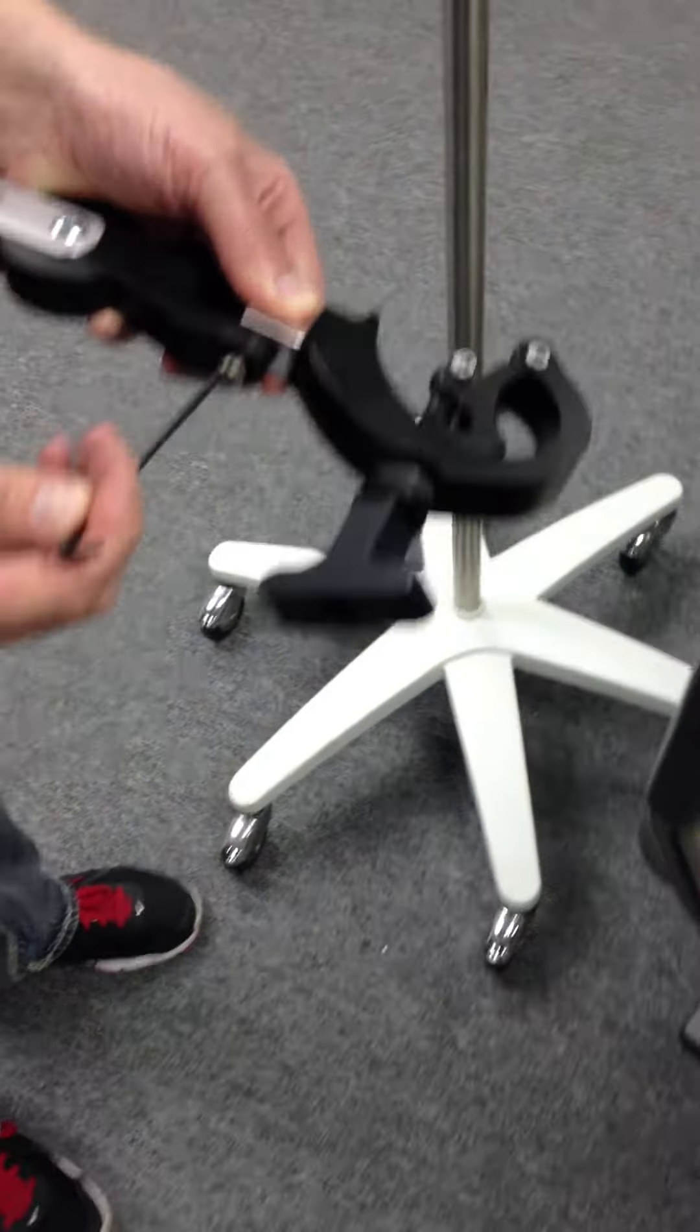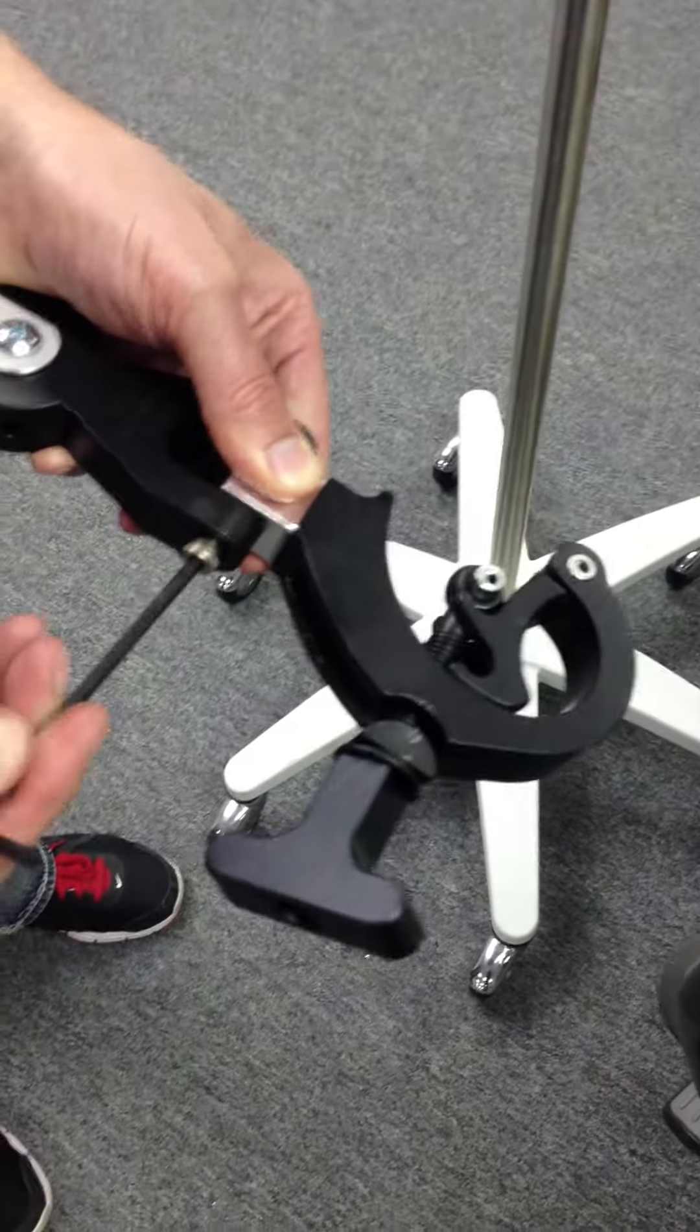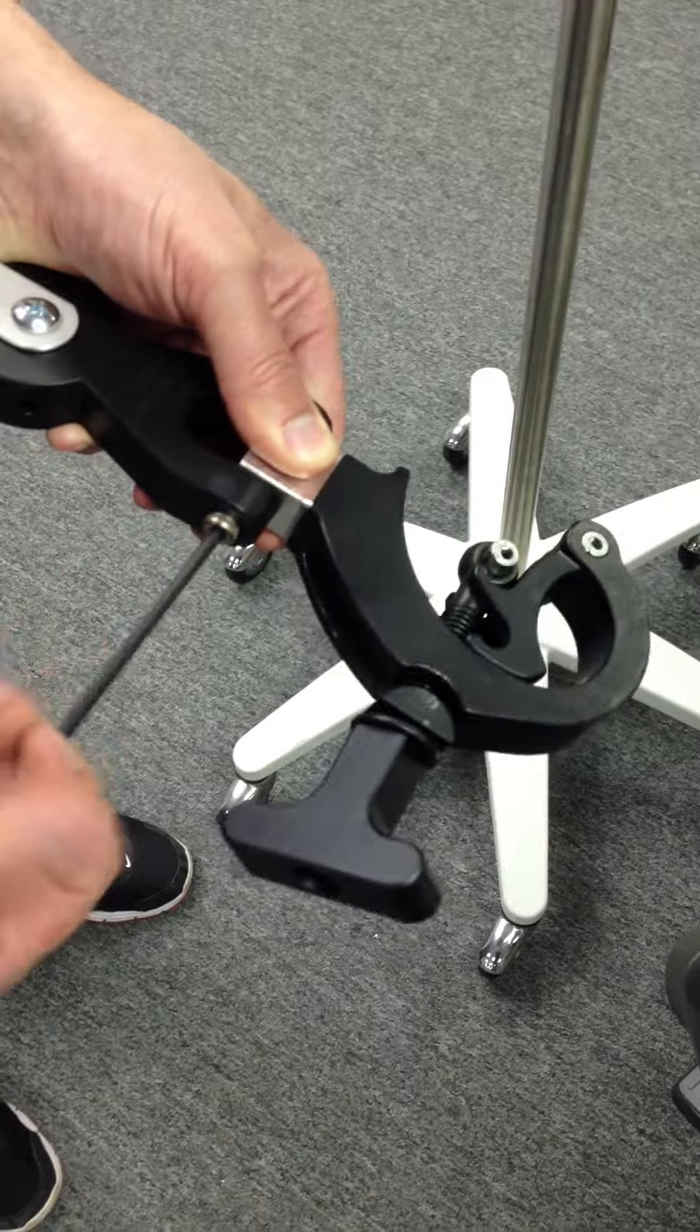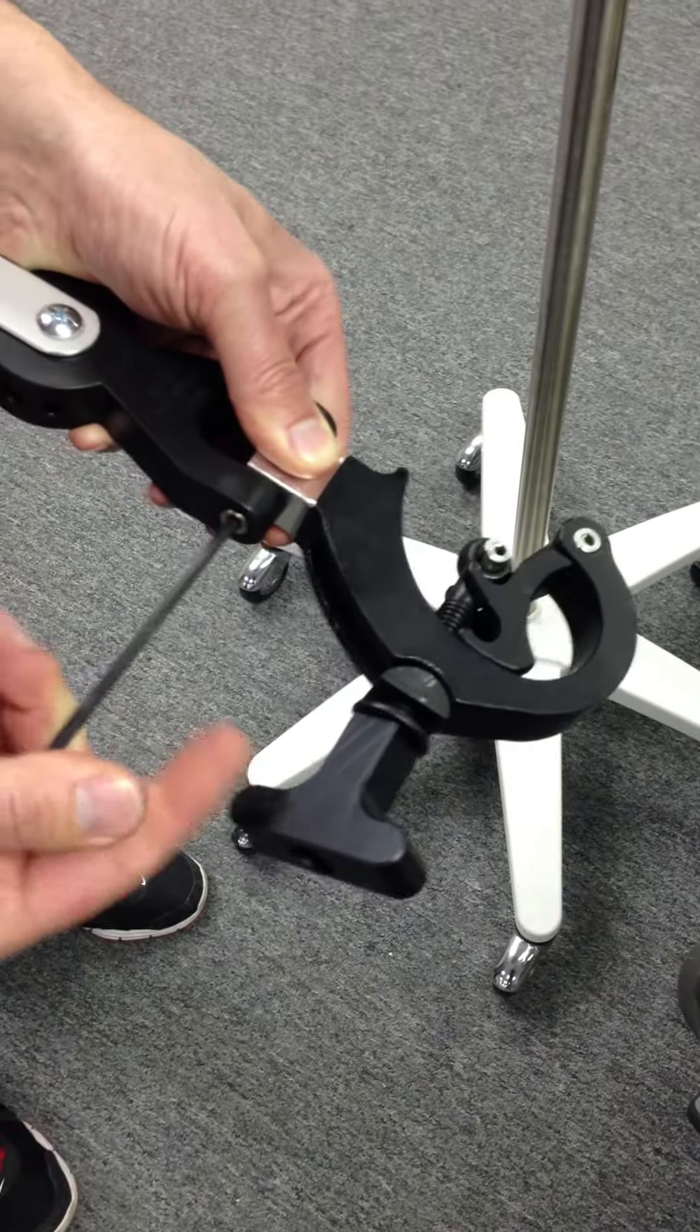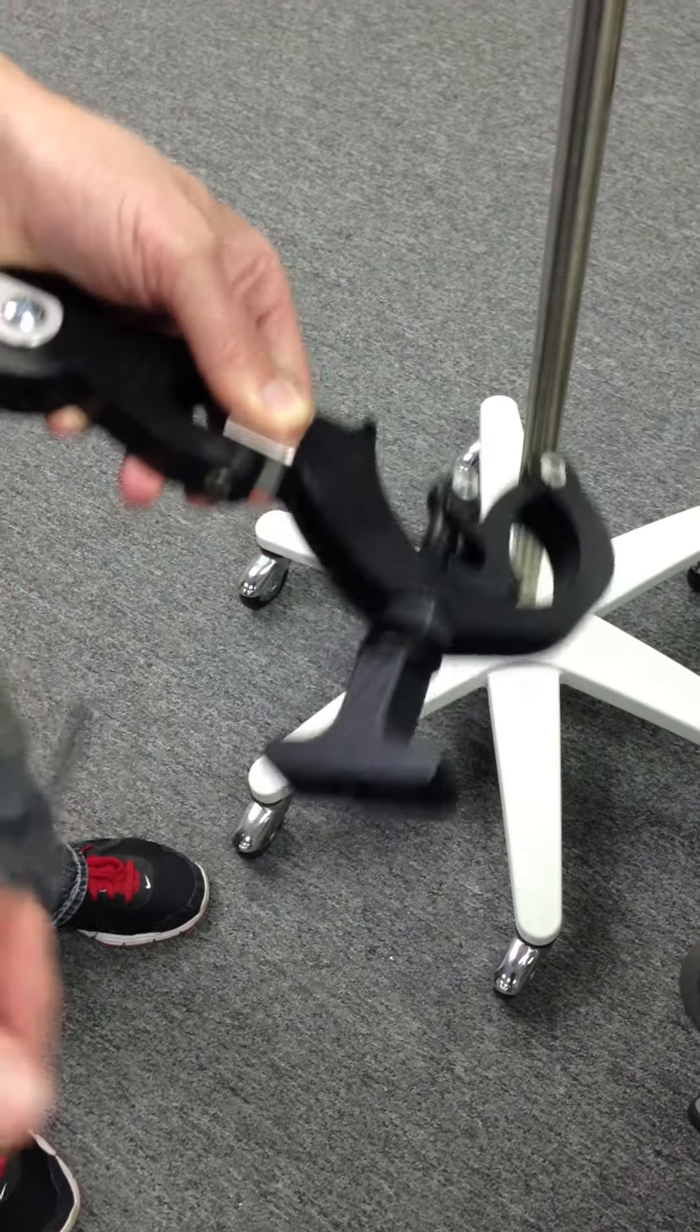Then you use the wrench, tighten that back up and now it's ready to go on.